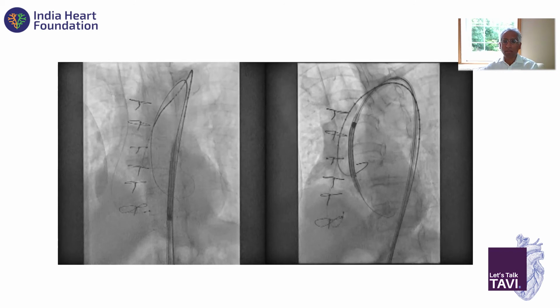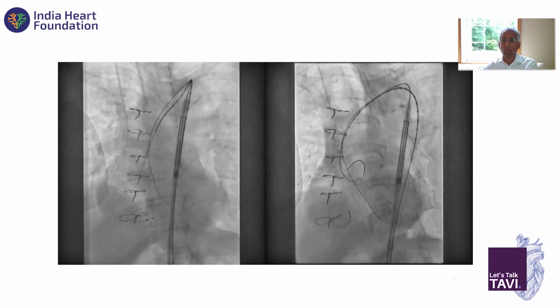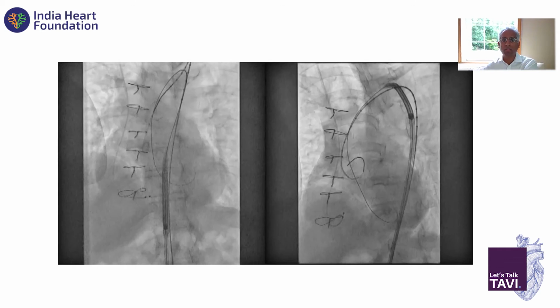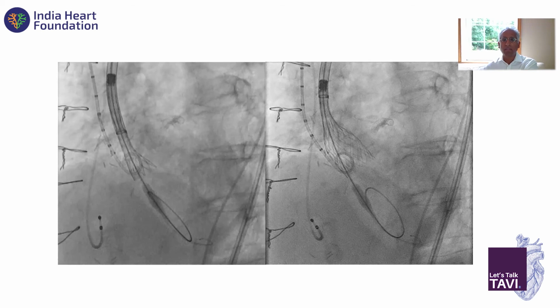Now, because this talk is really on access, I'm going to skip the next few slides because we can talk about valve positioning in the next session on positioning. But I think what I'm going to show is, I'm going to skip all this and go to this point.